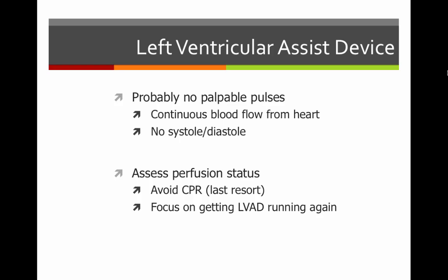So the first thing to do, and the most important thing to do with these patients, is just to assess perfusion status. Is it adequate or is it inadequate? If it's inadequate, we really need to focus on getting the LVAD functioning again. Maybe it's a battery malfunction, a battery failure, maybe they need to be plugged into something, maybe a lead has come misplaced, some wiring has come displaced. So we need to focus our efforts on getting the LVAD working again.